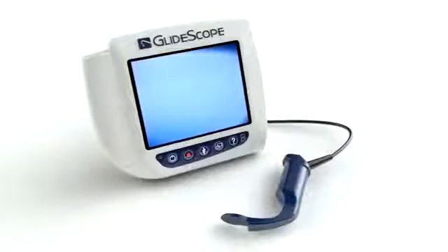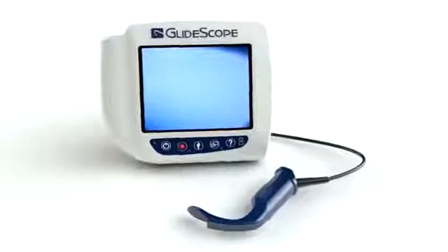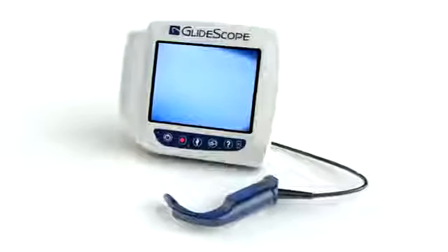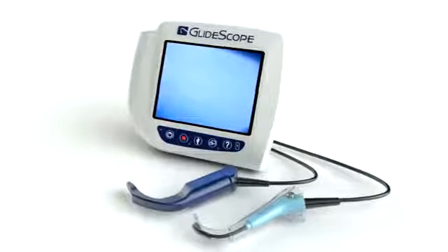The GlideScope video laryngoscope is also available with a reusable GVL2 blade option for pediatric patients in the 4 to 20 kilogram weight range. The basic technique to successful pediatric intubation with GlideScope video laryngoscopy is the same whether a single-use stat or reusable blade is used.